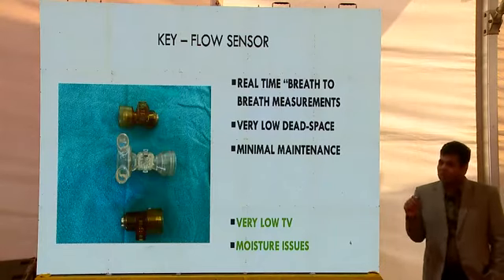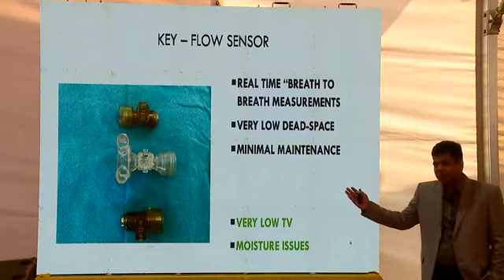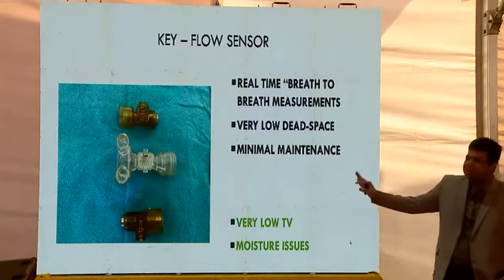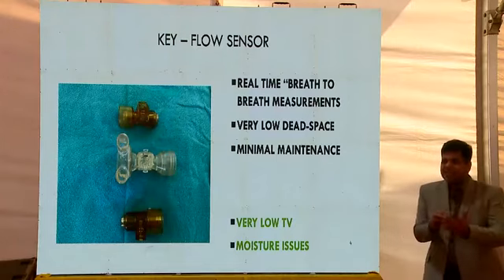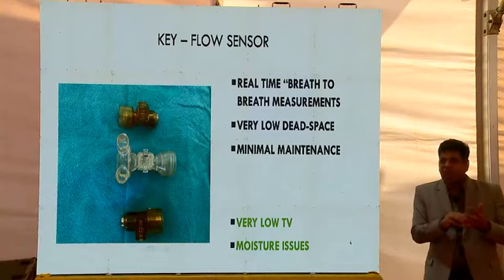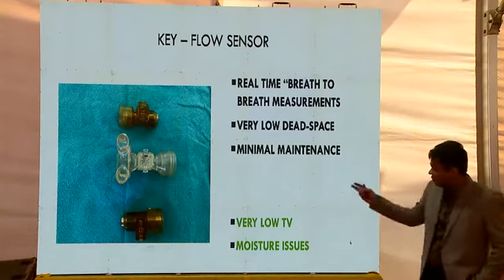calibrated. You should not be just happy by putting the baby on assist control or SIMV mode, and if your flow sensor is not working, the ventilation switches back to the CMV mode or the IMV mode. Means synchronization or whatever the baby is taking, the calculation of flow, the calculation of volume, it is done by this entity which is called the flow sensor.